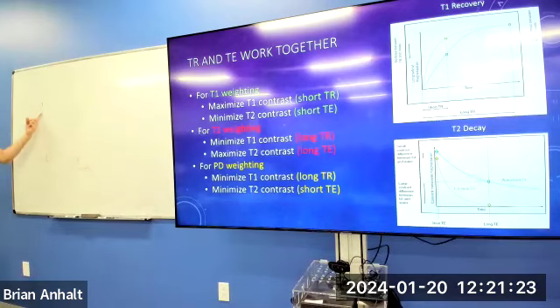We still have contrast because fat had a larger NMV to begin with, right? The contrast is just based off of what at this point? Yeah, the proton density, the amount of protons that were there to begin with. And since fat has some more protons than water does, it's going to be a little bit brighter than water. Contrast is very minimal, but this type of proton density weighting has the most signal.